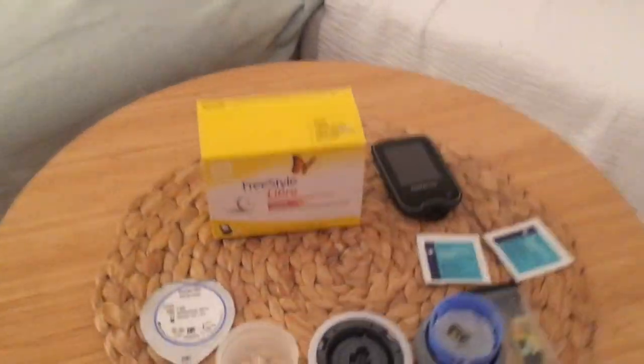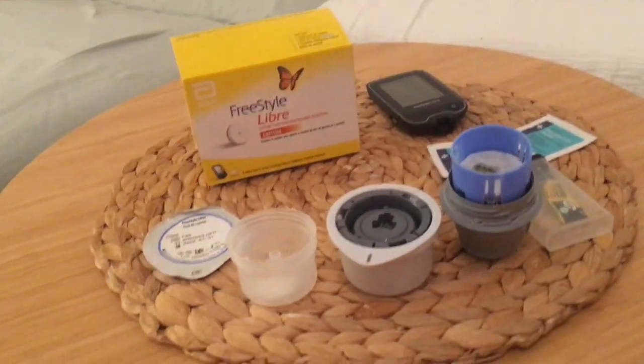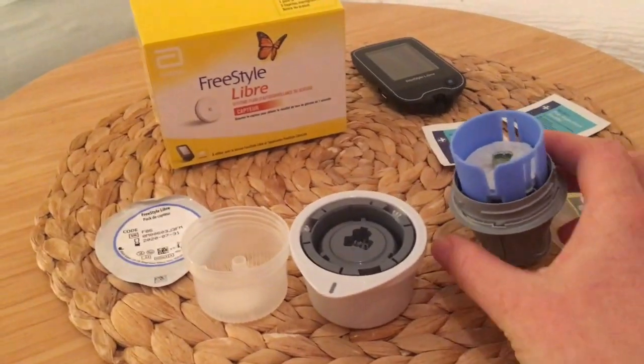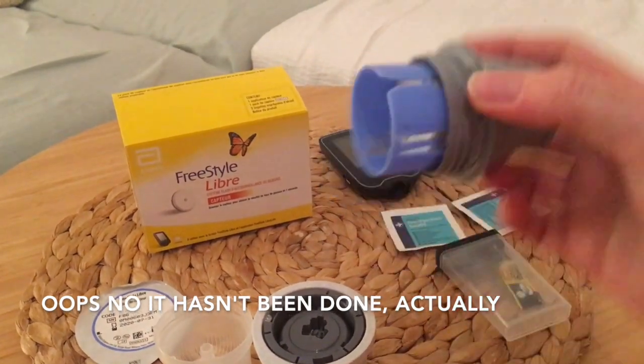I'm going to show you the gear. This is the box the sensor comes in — it comes in two parts. The sensor is actually in here, and then you take it out. That's already been done, so this is the part that you use to apply the sensor.